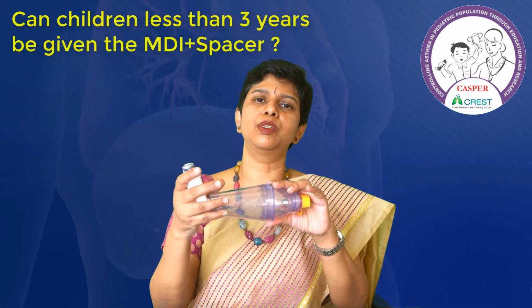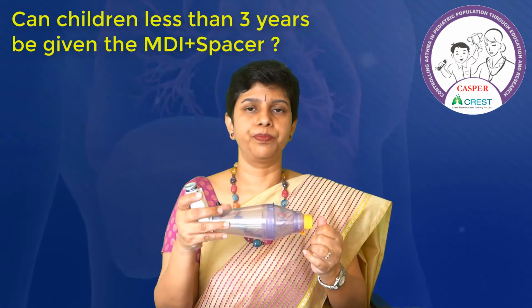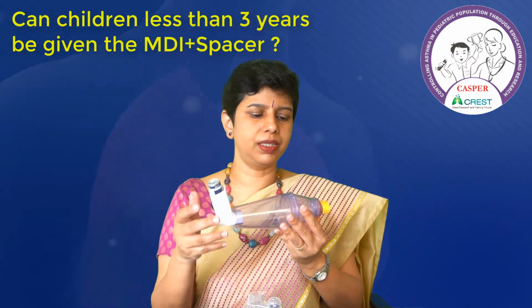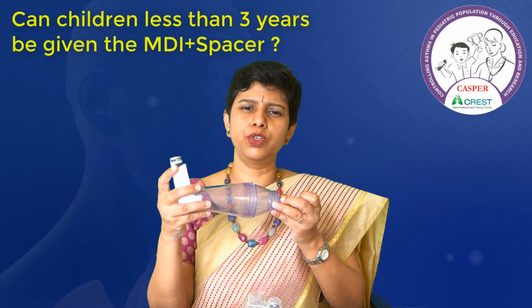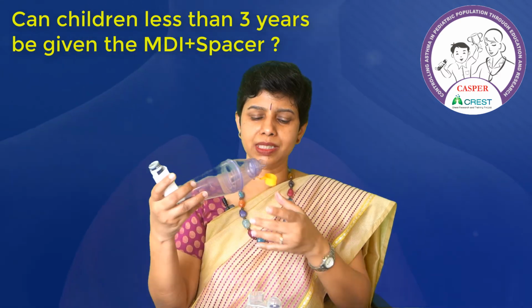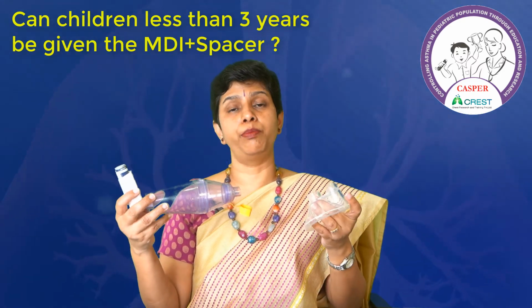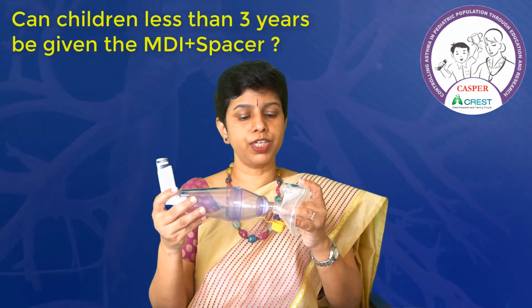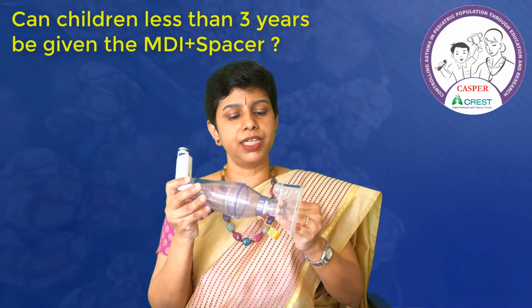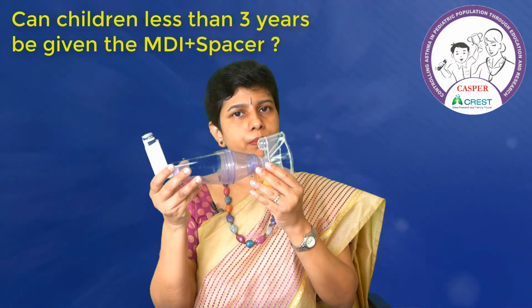Now, some important aspects about MDI and spacer. Can children less than 3 years be given an MDI and spacer? They can be given, but along with a mask, because younger children usually may not be able to breathe in and out of the device. So it's very important that for younger children we use this additional device, which is the spacer with a mask.